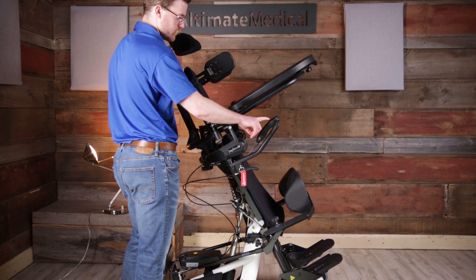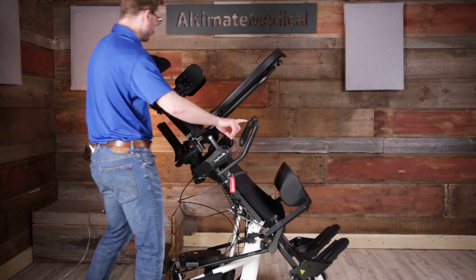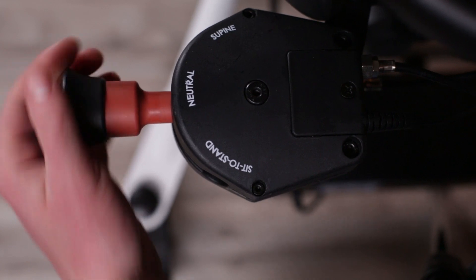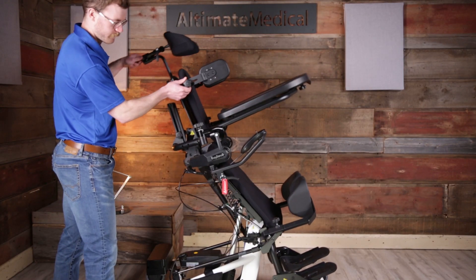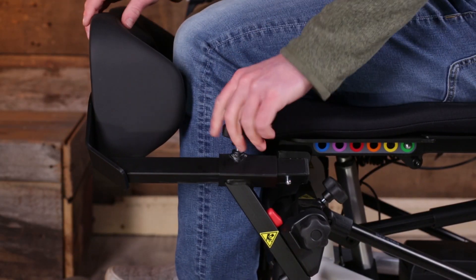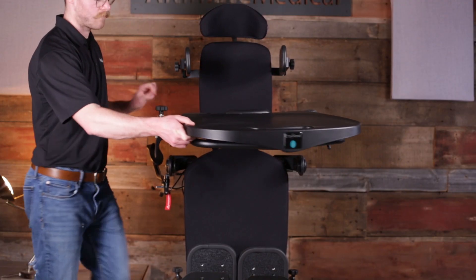The nucleus of the Bantam medium is the central positioning controller, which puts you in control of deciding how the unit changes position. In the neutral setting, the user can be positioned anywhere in between sit to stand and supine, and the angle of the back and knees can be manually adjusted. This, with the optional swing away knees and swing away shadow tray, makes finding the perfect transfer position easier and accommodating tightness and contractures manageable.